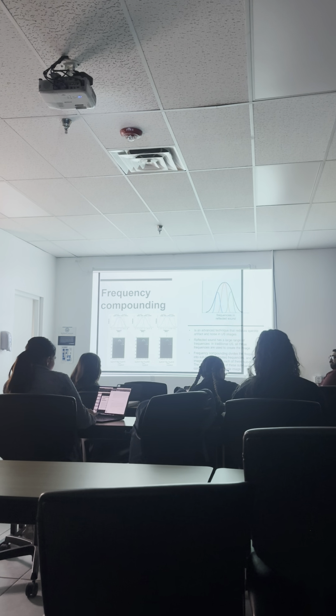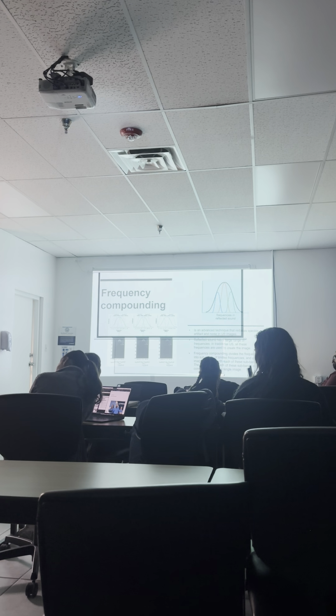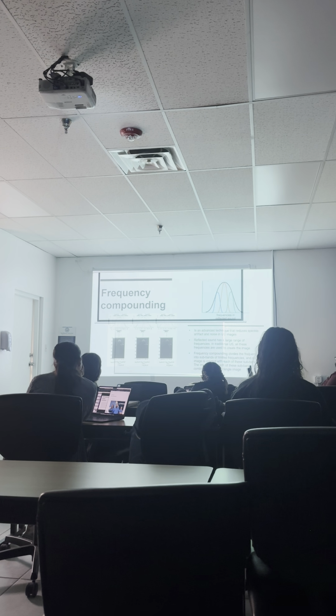It's combining different frequencies to create the bigger picture. But where are those different frequencies coming from? From the body.